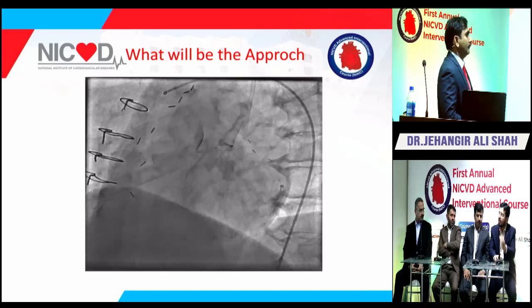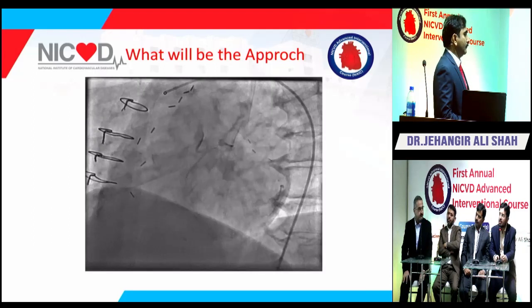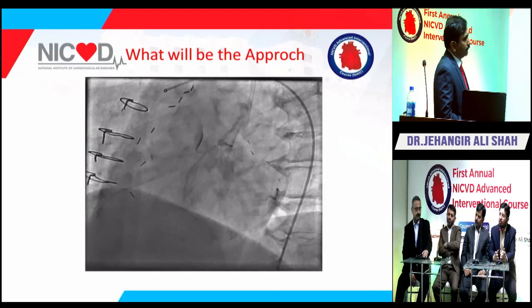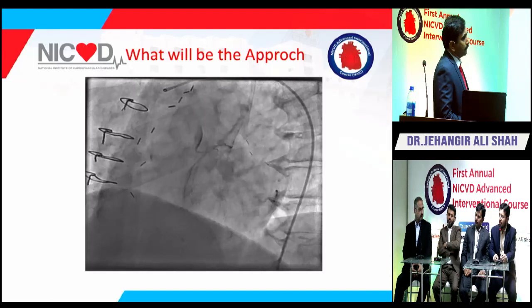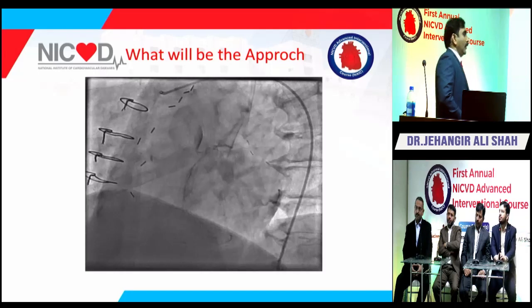One thing which we will do, if we will not use the embolic protection device, then we should use pre-medications to avoid the slow flow. That we should do. The rest, I agree with Dr. Atif, to continue in the same manner. Dr. Gulzar?